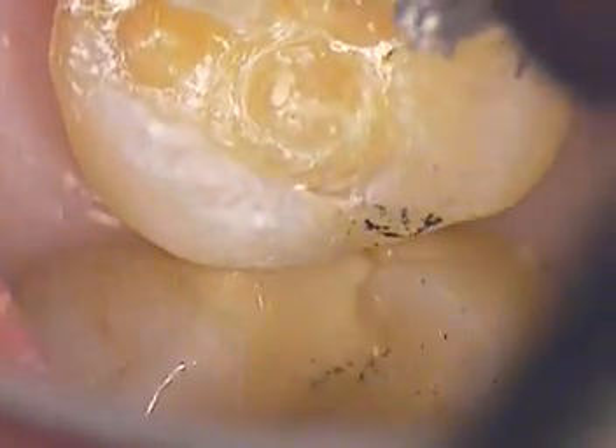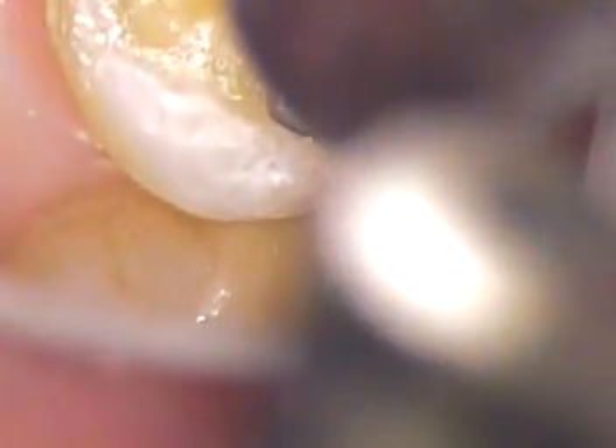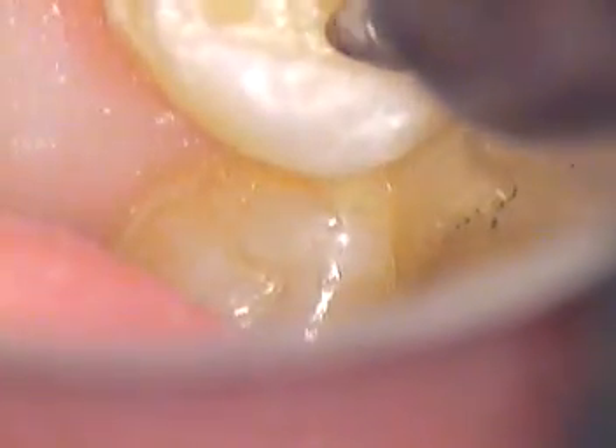Now I've got to get down in that area. There's another spot on the x-ray on the distal, so I'm going to go through that now. You'll see how that changes color — and you see that? That's the distal area of decay. So we'll open that up and see if I can conserve some of this enamel.